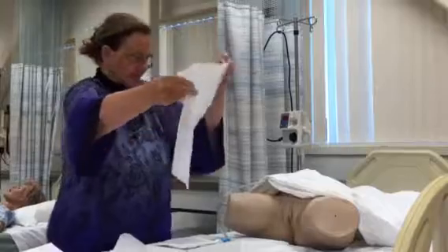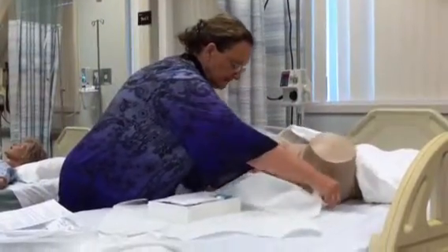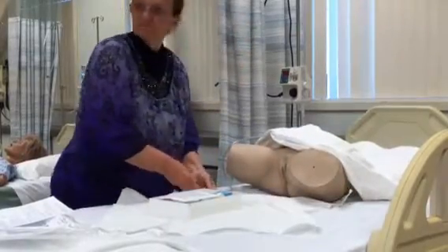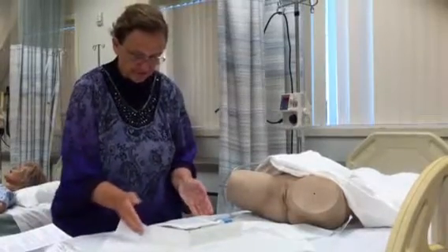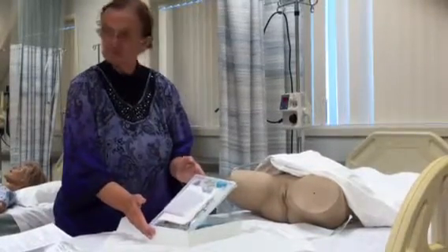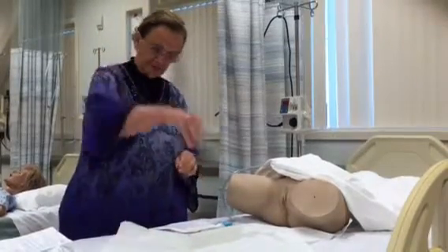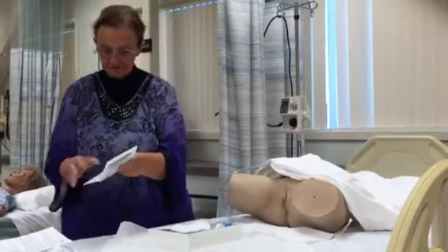So I'm going to go ahead, and if the patient can lift their buttocks, I'm going to ask them to do that. If not, I might have somebody help me, or if I can get them lifted on my own, I will do that. So you'll notice in my box, the next thing that comes is a set of gloves, correct? So I'm going to grab the gloves in the middle so I'm not touching anything else with my hands.